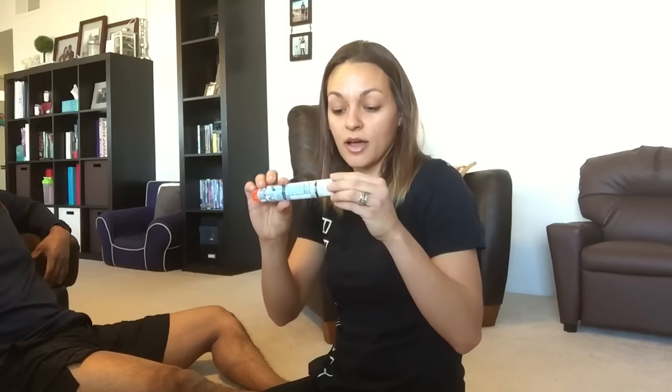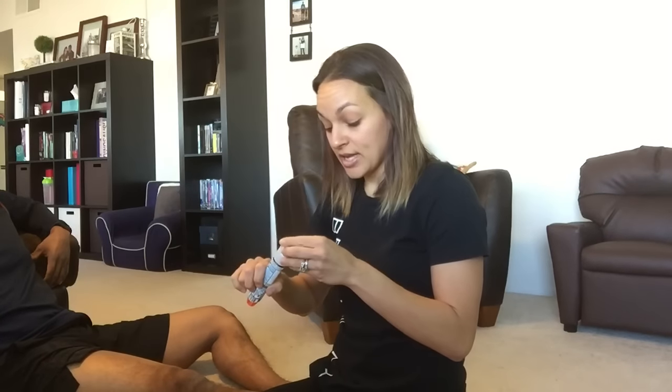I've practiced a few times with the practice auto injector — it always looks different, it's gray. You just pull the top out, then put this part in the meaty part of the thigh, press down, and hold for 10 seconds.